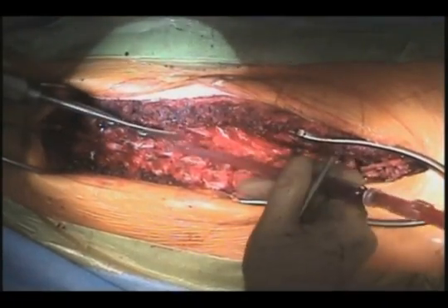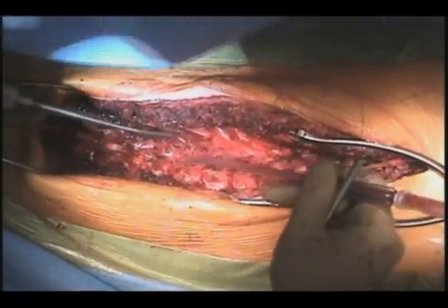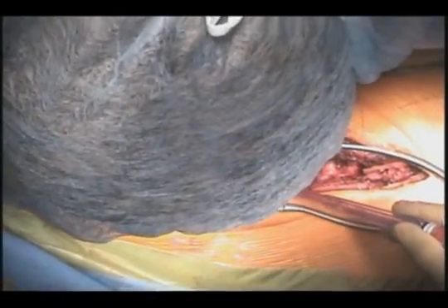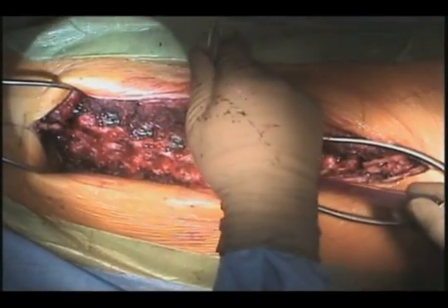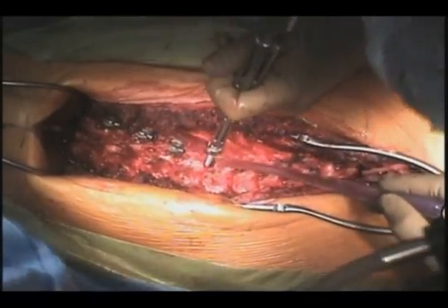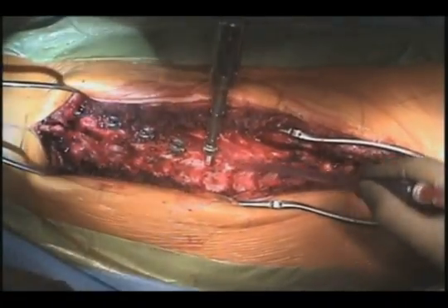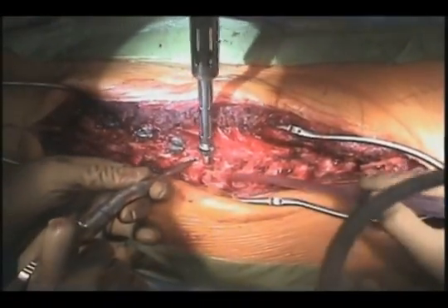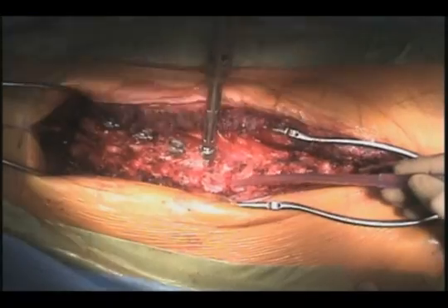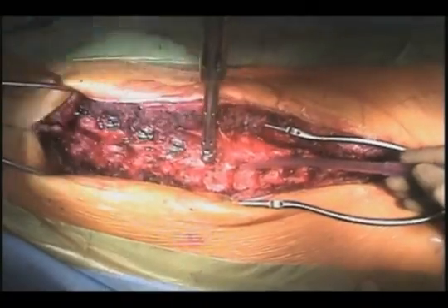At the proximal and distal ends of the construct, I use a polyaxial screw, mobile in all directions, and at the intermediate segments I use the uniplanar screws. Again, this enhances our ability to correct rotation. And so here, moving my way up the spine in a cephalad direction, placing screws segmentally at each level gives us maximal control of the curvature. And the key is to place these harmoniously so that the uniplanar screws line up in a harmonious fashion, because there is no variability that is afforded by a polyaxial screw.